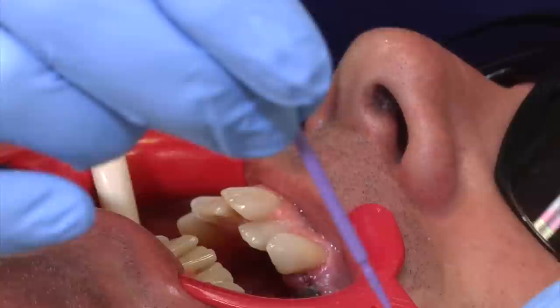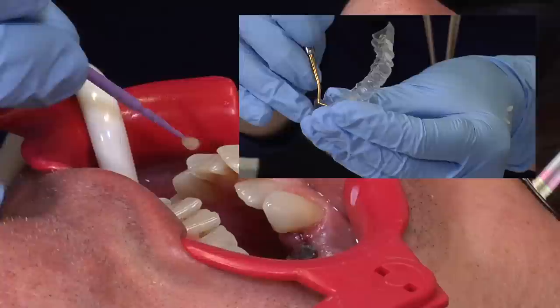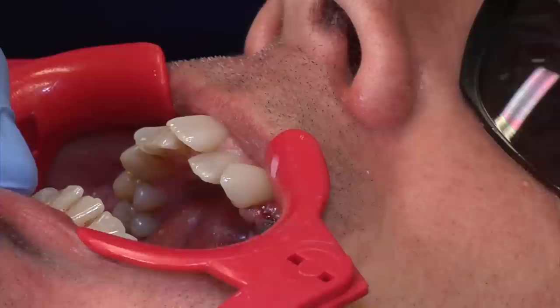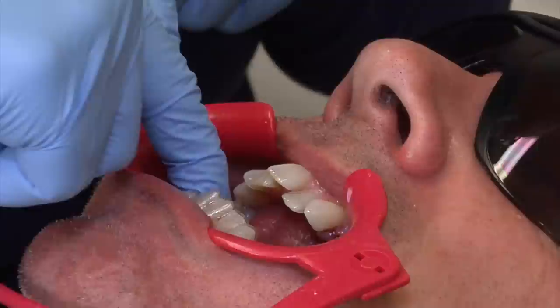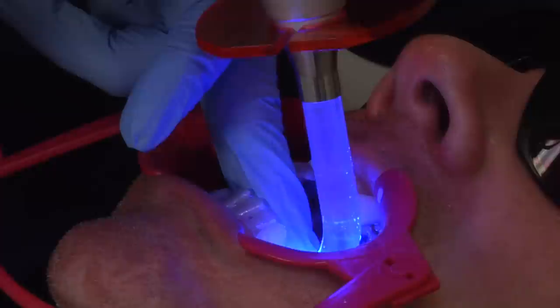Now we're going to apply the one-step primer to the teeth, painting all the teeth where we're putting the attachments. Then we're going to start loading the tray with glue. Now that all the glue has been put into the template, we're going to insert the template on the teeth and cure it with the light. We'll make sure it's fully seated, pushing down everywhere on the biting surface, and then we'll start to cure the glue.